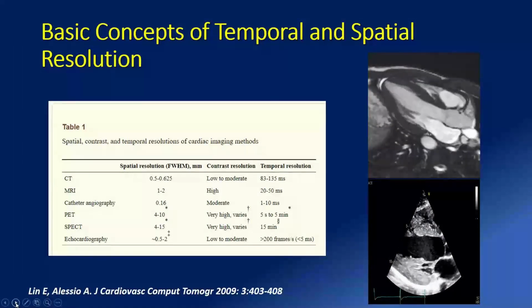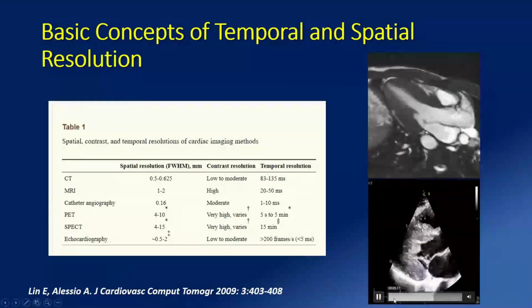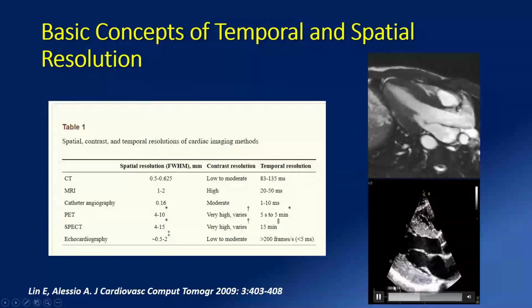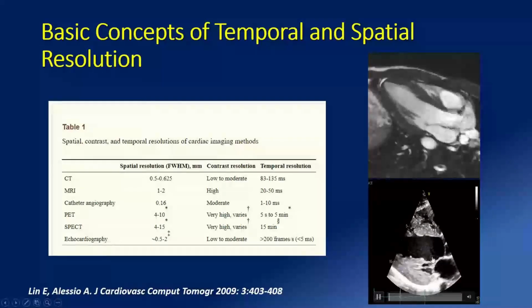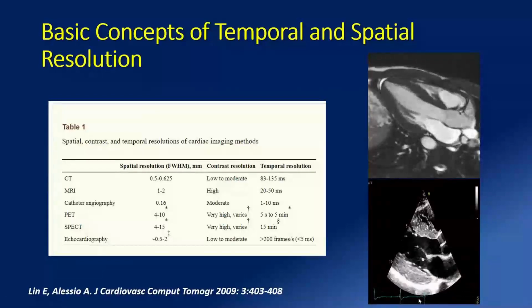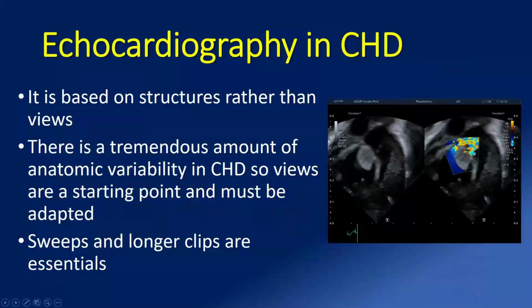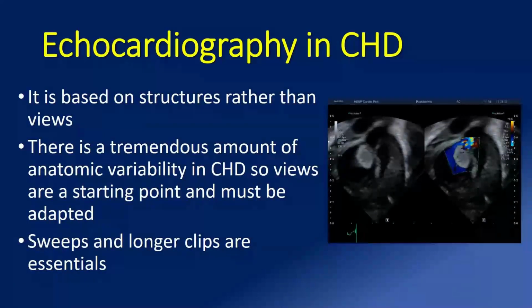The patient is the same, but on the CMR, you will see that we cannot catch the anterior motion of the subvalvular apparatus, which is quite obvious on the 2D grayscale images using ultrasound. This is due to the fact that echocardiography is the technique with the highest frame rate. And also, echocardiography has a very good spatial resolution.